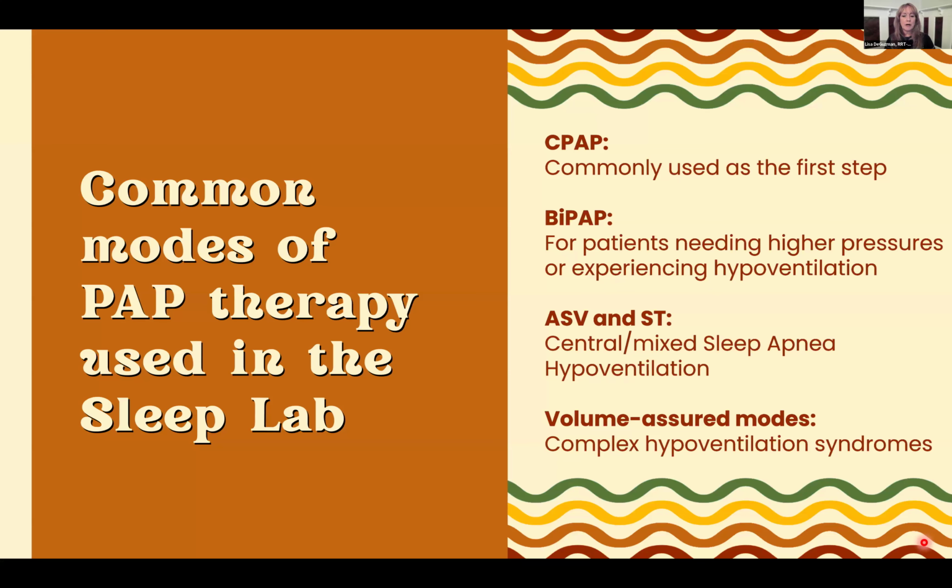One thing I didn't include in this presentation is KPAP. It's kind of a reversal, and I've not used it, so I'm not real familiar with it, but that has shown up, and that's increased pressure on exhalation and decreased pressure on inhalation. So that is something that we'll look at in the future for my presentations. But so CPAP, BiPAP, and then when we move into central and mixed apnea patients, our complex patients, ASV and the ST mode on BiPAP can help when we start throwing central apneas into the mix.